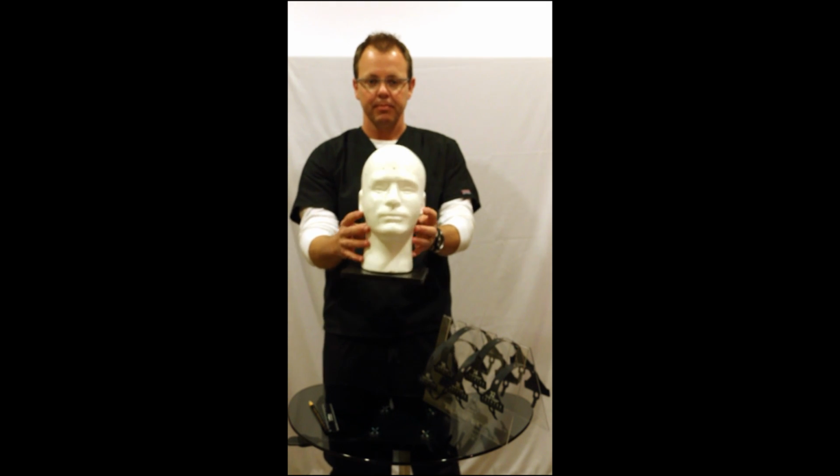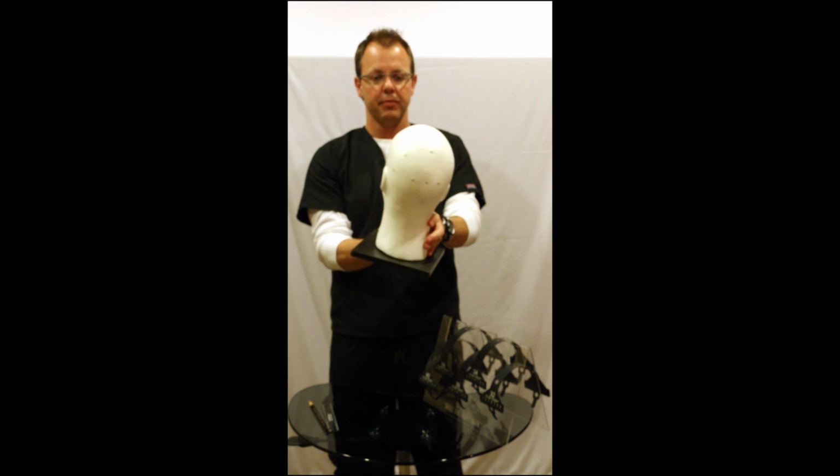And just like that, we have measured a full EEG.